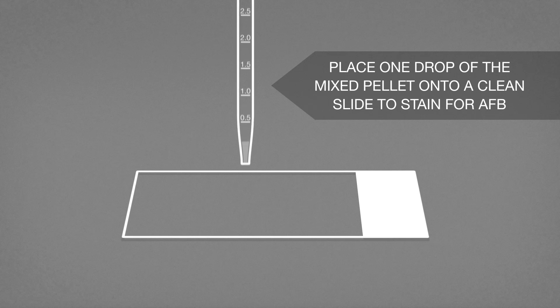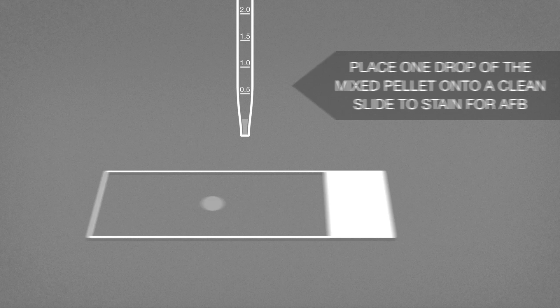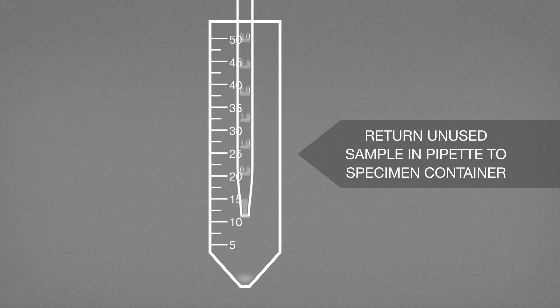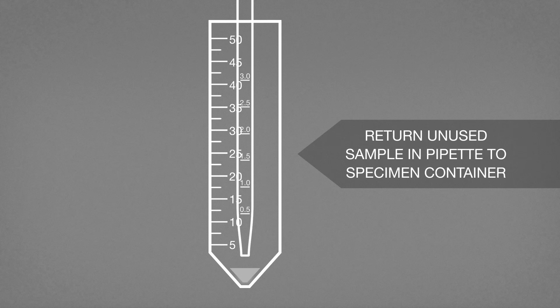Place one drop of the mixed pellet from the pipette onto a clean microscope slide to stain for acid-fast bacilli. Do not touch the slide with the pipette. Return the unused sample remaining in the pipette to the specimen container.